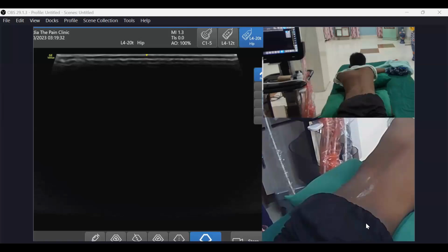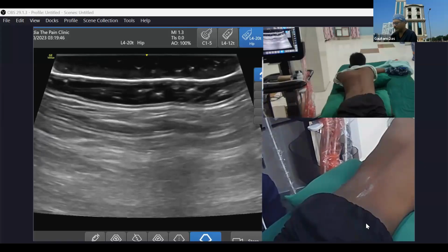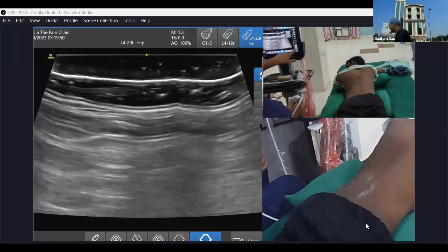One last time, transforaminal, can you? Transforaminal epidural. Yes, sir. Okay. Transforaminal epidural is not usually done, but we have a very nice technique of our own. You can see that on YouTube also, it is there. I will not be recommending the transforaminal epidural, but still, it is possible.